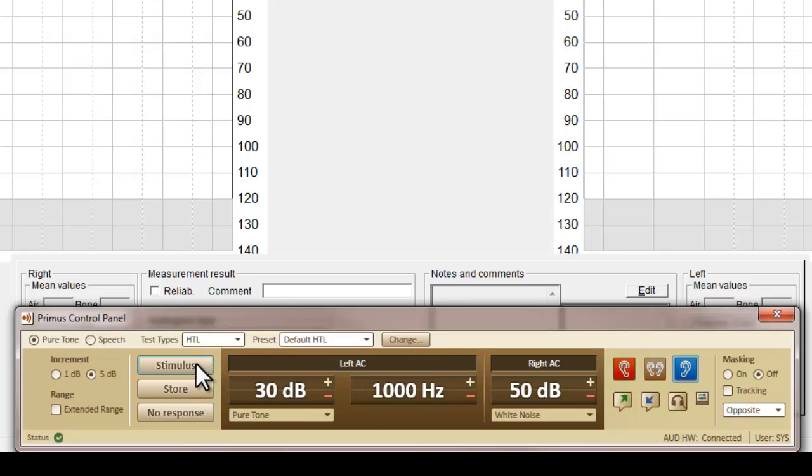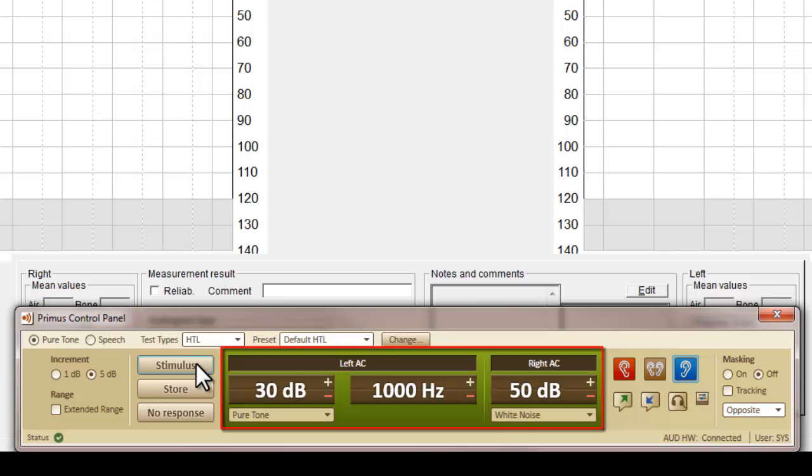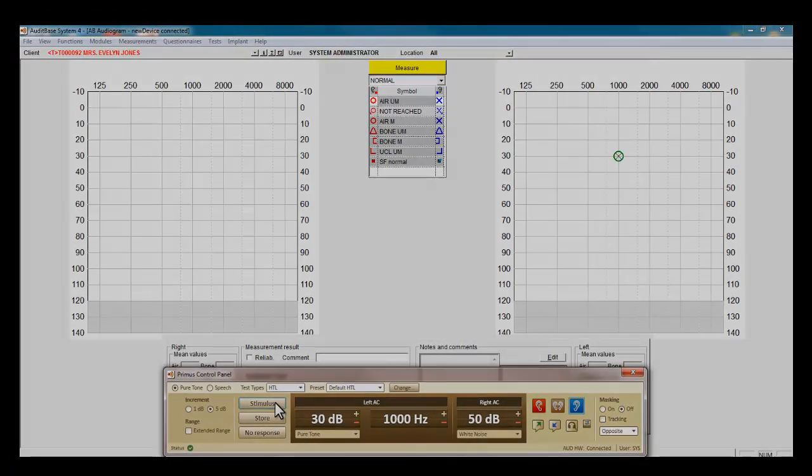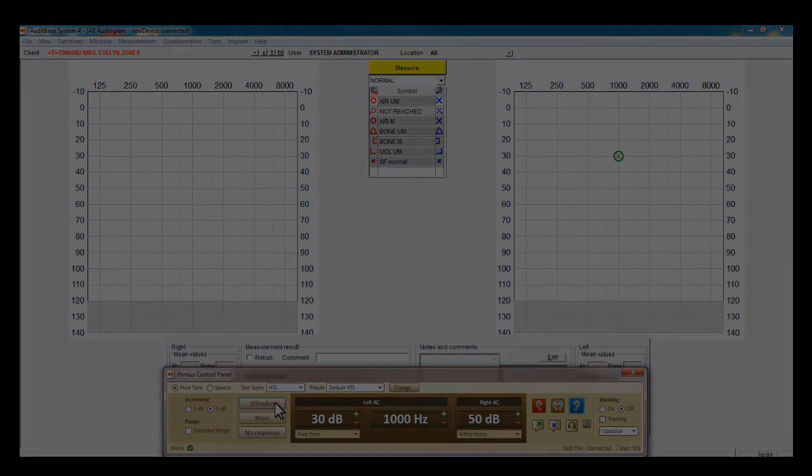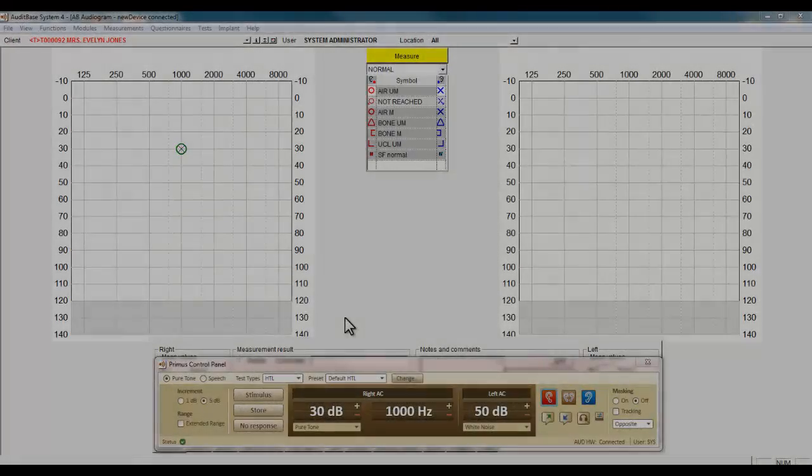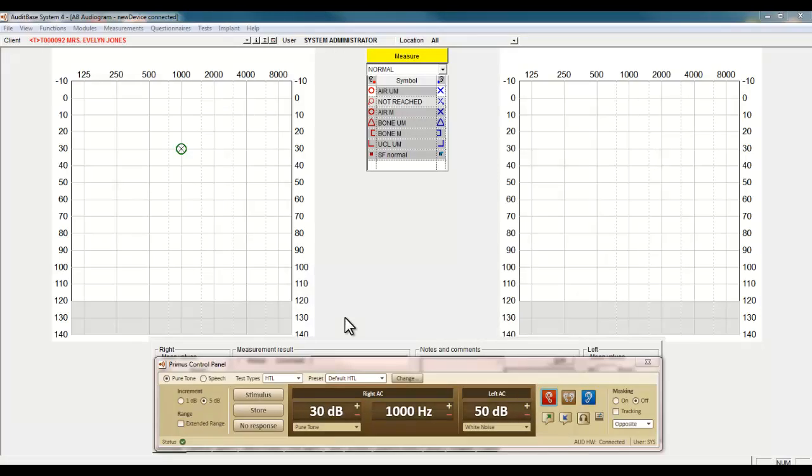When the client hears the tone presented and responds accordingly, the central panel will illuminate green. You will now see an audiogram being completed using the Primus panel.